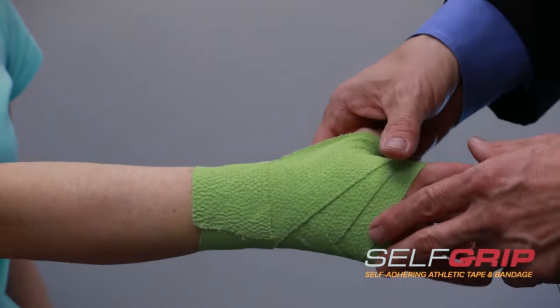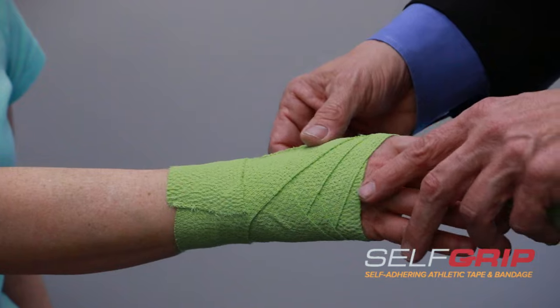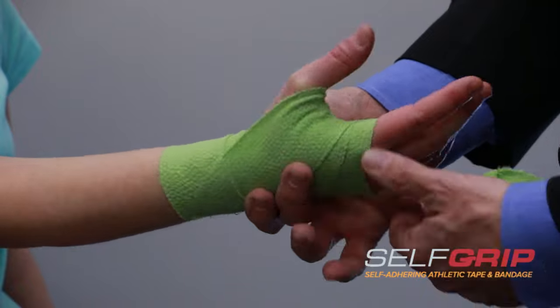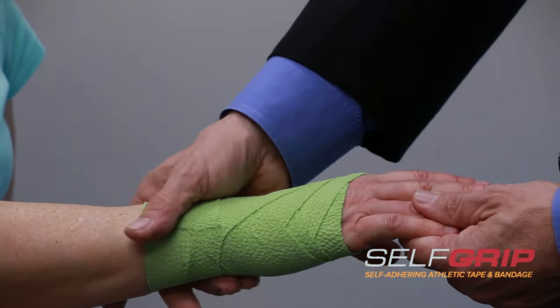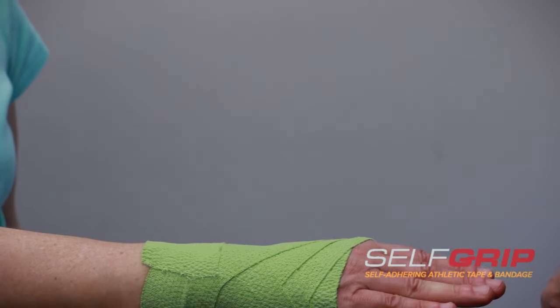What we've done here is stopped the wrist from bending forward, and you can see the line supporting the wrist, where on the other side there's no protection because that's not the direction we're trying to guard. With self-grip, every tape should be patted down to make certain it's adhering well to the skin or to the injured area.